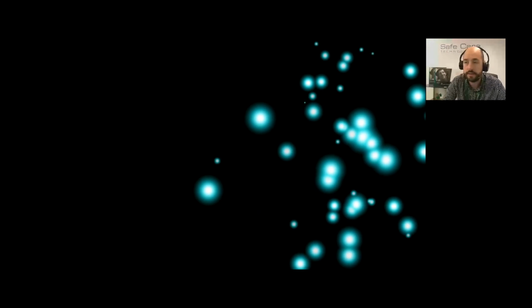I can do that, or I can simply just say, appear. And that dot will appear on the screen for me. Then I can say, disappear, and it will disappear for me. So it's getting rid of that idea of even having to use the keyboard and having the escape buttons and things like that. It's just a quick access method for you with the voice commands. These are editable as well. So you can actually edit the voice commands to specific words that you want.